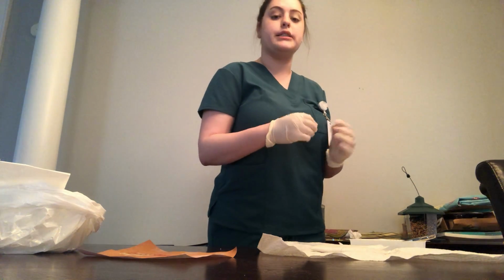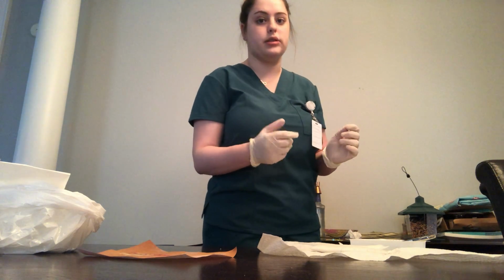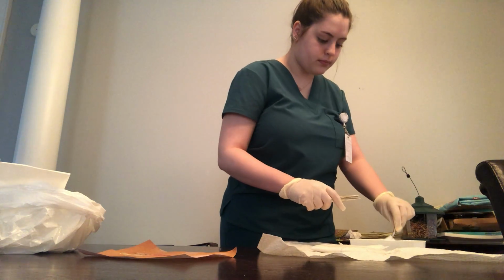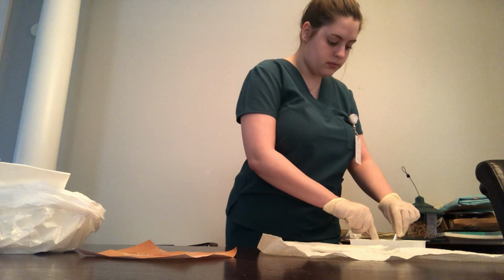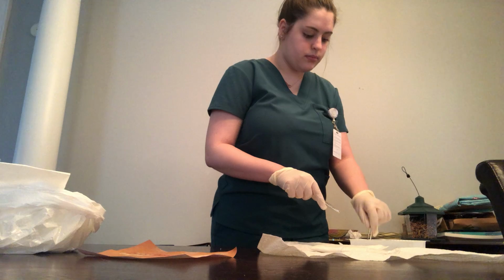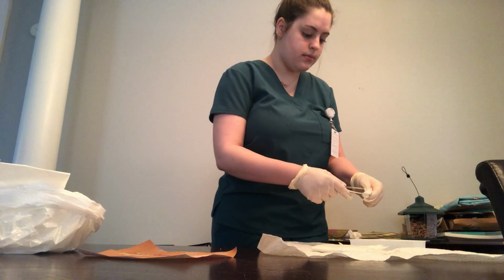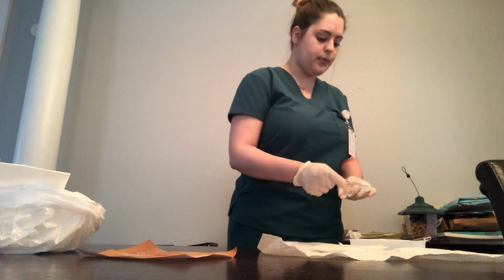And I'm going to use the hand closest to the wound so that I'm never reaching over the sterile field. So the first thing I'm going to do is take my forceps. Dip it into the solution and squeeze it out so that it almost looks like a rosebud. And you clean top to bottom on a wound.